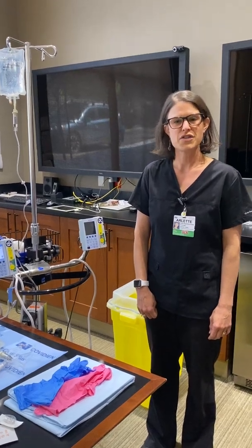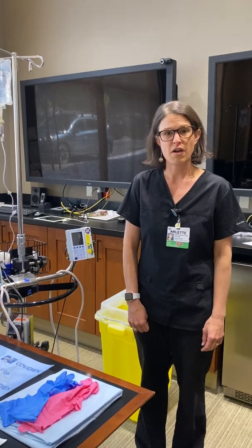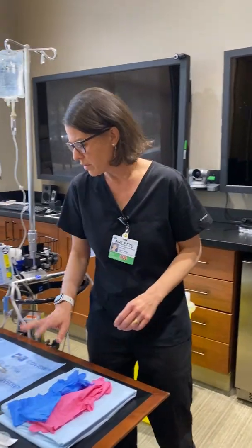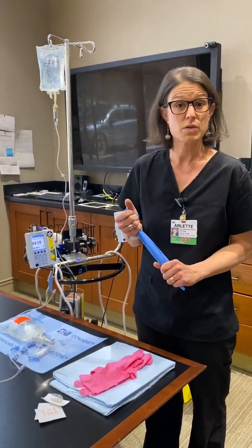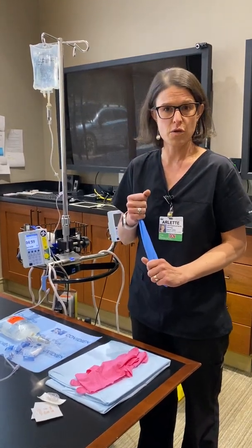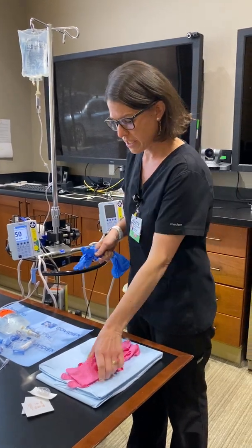My name is Arlette. I'm one of the Cancer Center Infusion nurses and I'm going to go over the donning and doffing of PPE specifically for chemotherapy. When you are getting ready to administer your chemo, the first thing you want to do is wash your hands, and then after checking your doses with your second cosigner, you can put on all of your PPE to get ready to administer chemo.